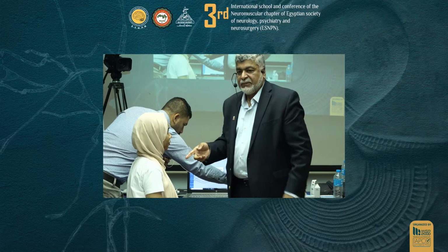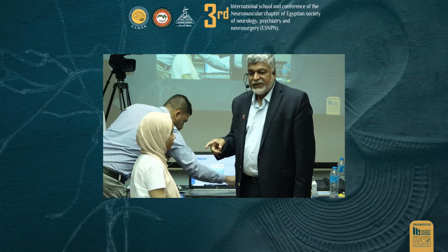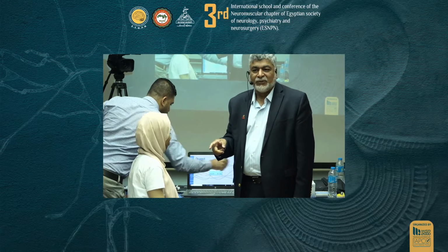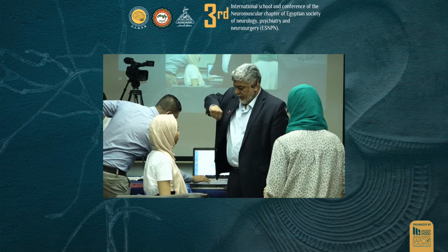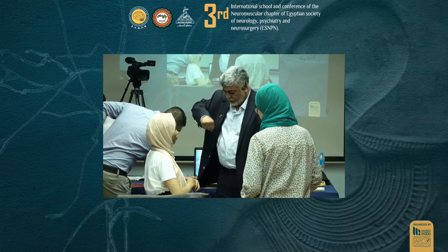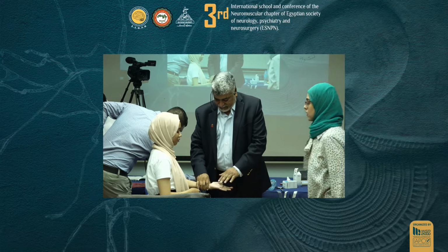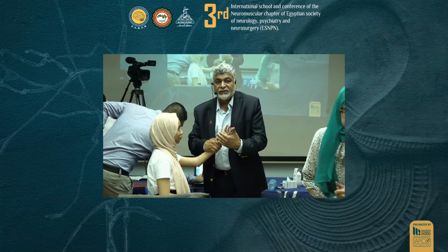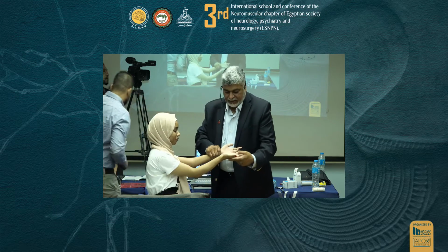This side you can see she can barely lift her arm. So I'll check the two deltoids. One distal and one proximal muscle to see what's going on, okay? Just for demo's purpose. Don't want to stick too many needles. Up. No, you can't? Okay. No worries. Open fingers wide. And I can see the flattening of the thenar and hypothenar muscles, wasting of the.